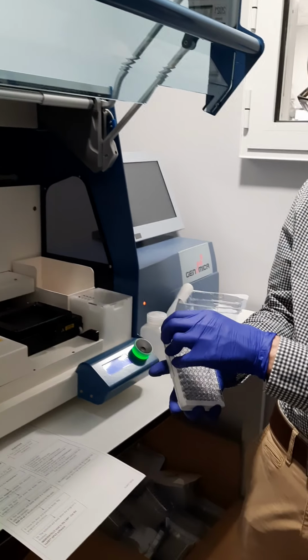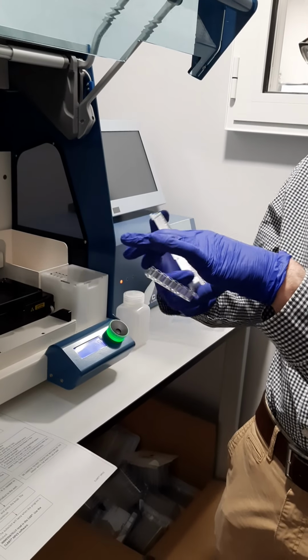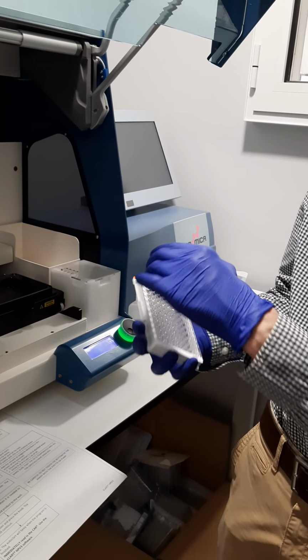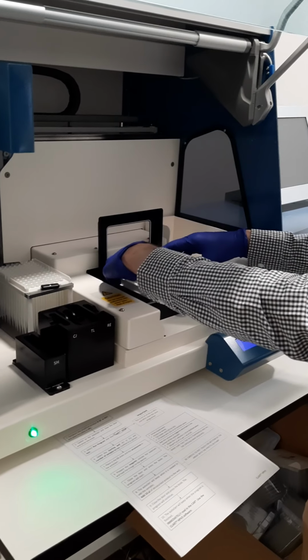So this is like a strip. Here is where they are printed, the microarrays. Okay, so the 8 positions, A1, and this is what it was asking, E1, for example. Okay, so imagine we place the microplate here.